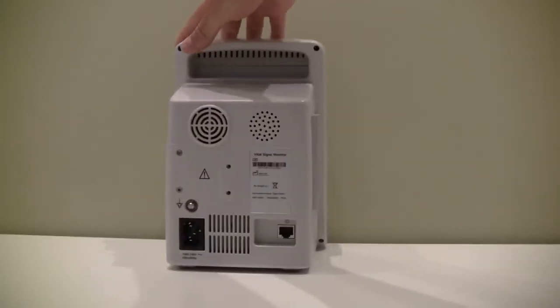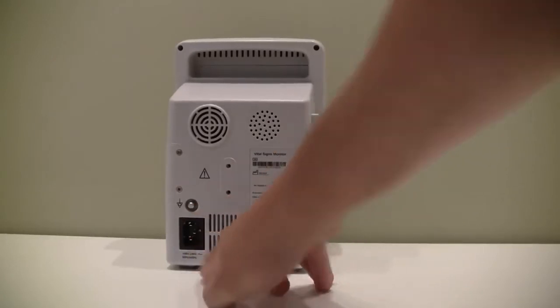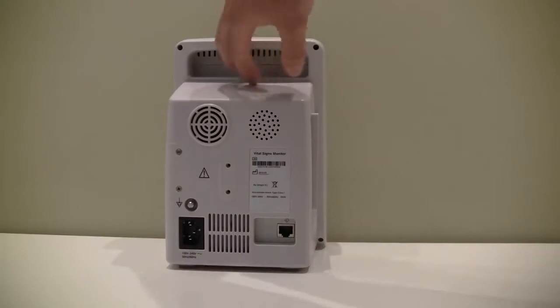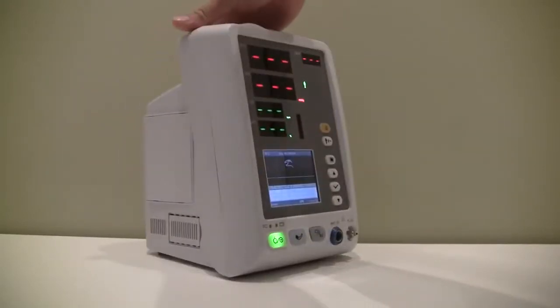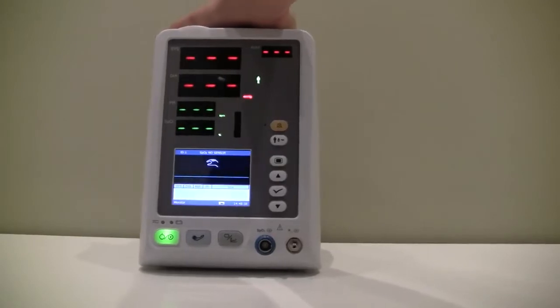The back of the unit, you can see you've got your grounding port here if applicable, your power supply, and there is an Ethernet port for networking this with the optional software, the low-cost software option to transfer data very easily to a PC.